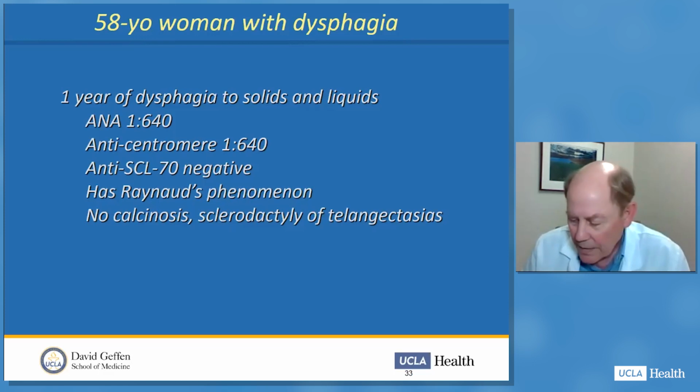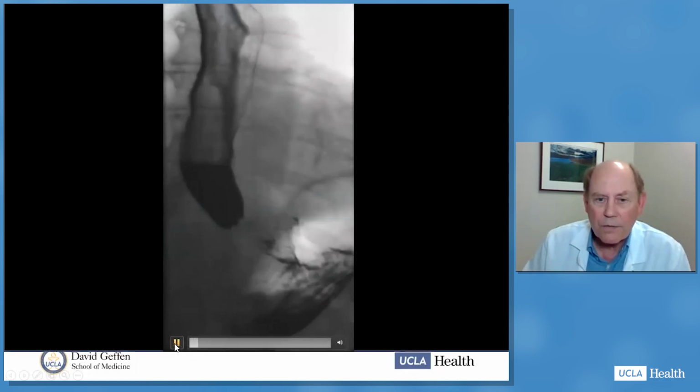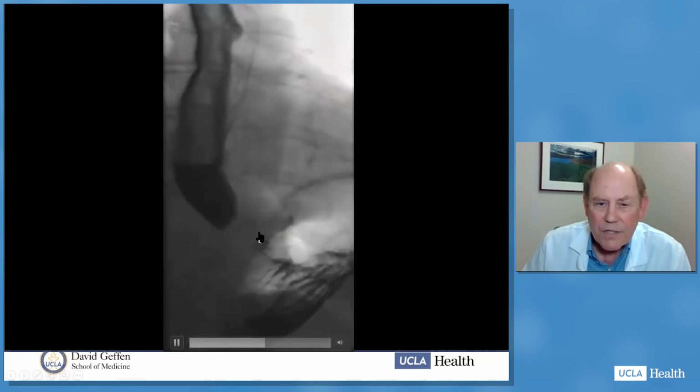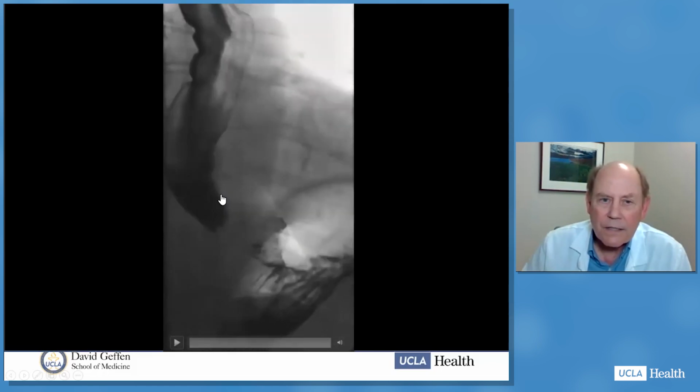Well, let's find out. So the workup then, she had an endoscopy, and the esophagogastric junction was normal. There's no stricture here, and you can see in the retroflex view, it's also normal. Maybe just a tad loose, but probably normal. Here is her barium swallow. And you can see that the esophagogastric junction here opens up, but it's just a little narrowed. And the radiologist said, it's just a little too narrow, not quite right. And also there's essentially no motor function in a slightly dilated smooth muscle esophagus.